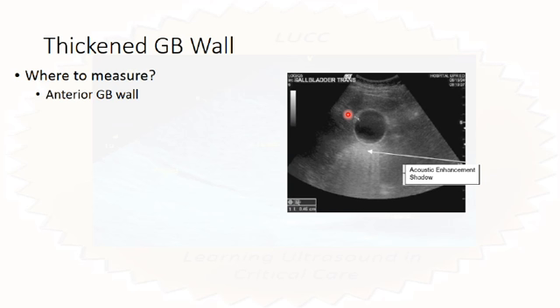I was told by a sonographer once that their practice is to use the short axis, and the reason is that you don't want an oblique view, because an oblique view can give you an artificial thickening of one wall of the gallbladder and thinning of the other wall. What you want is a perpendicular slice of the gallbladder, and it's very difficult to ensure that in the longitudinal axis. Whereas in the short axis, you can aim for a round gallbladder, and that means you're not cutting it obliquely. So that's my practice as well.